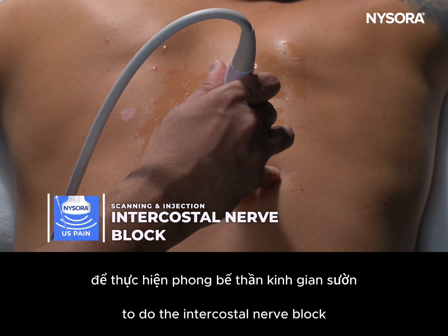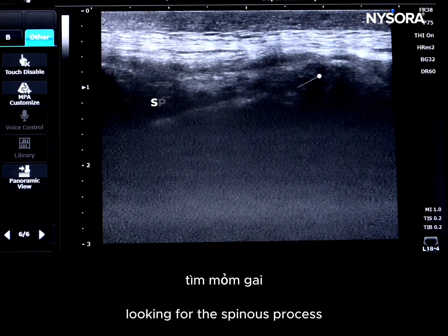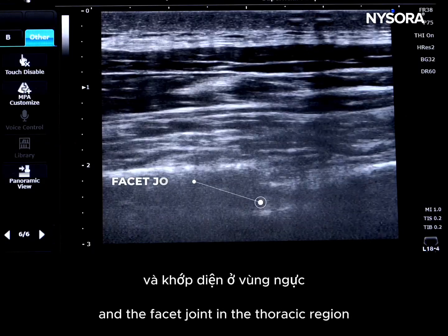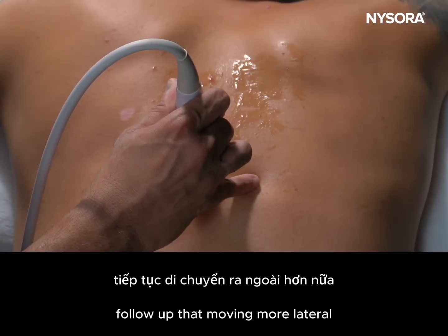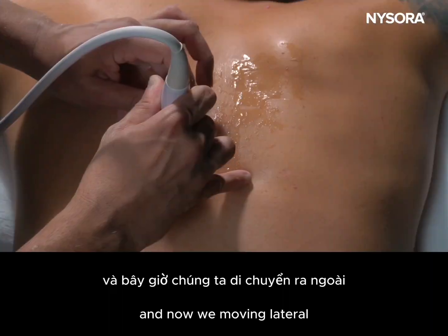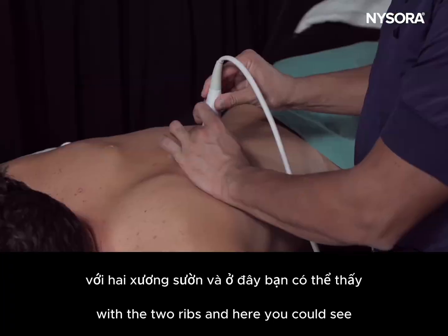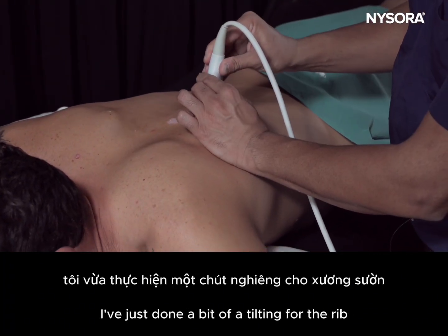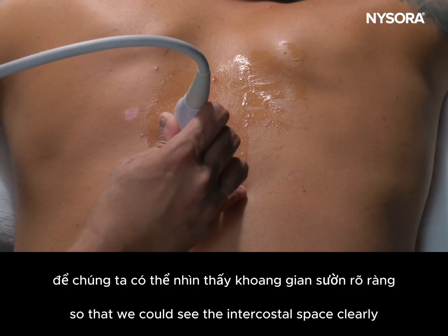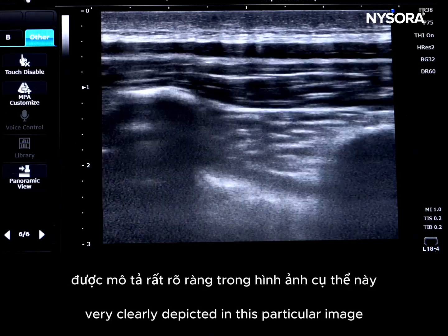To do the intercostal nerve block, start to scan from the midline. As we always do with midline scanning, look for the spinous process, moving lateral, looking for the lamina and the facet joint in the thoracic region, followed by moving more lateral. Here we have the transverse process, and now we're moving lateral, and here we have the intercostal space with the two ribs. Here you could see I've just done a bit of tilting for the rib so that we could see the intercostal space clearly. And now we have the intercostal muscles very clearly depicted in this particular image.